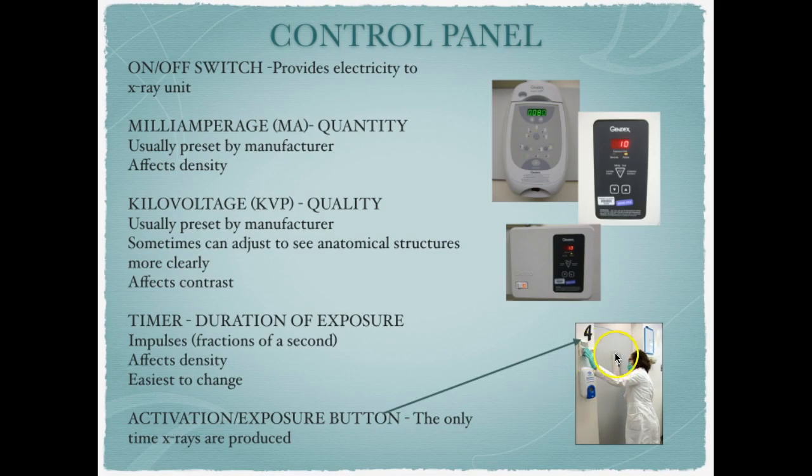So we want to protect ourselves from the dental radiation, and we are also required, mandated by law, usually by the dental boards and the departments of radiological divisions in your state, to be a certain spacing away from the dental x-ray unit. So our activation buttons are usually outside of the room, and that's the only time when we press that button that x-rays are actually produced in the tube housing.